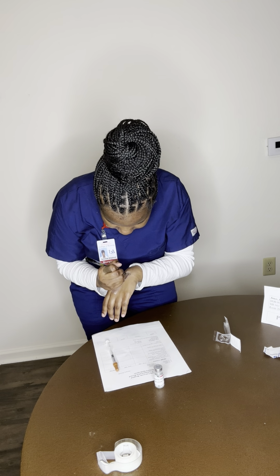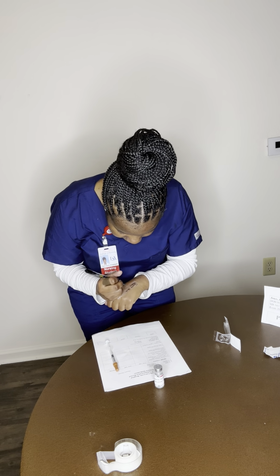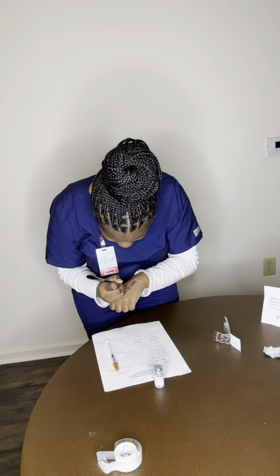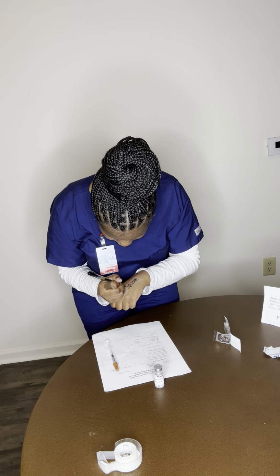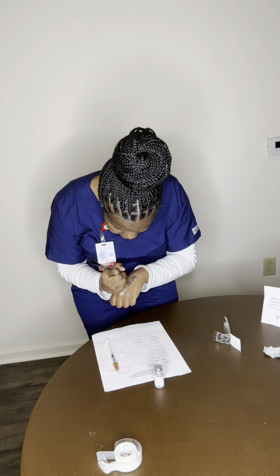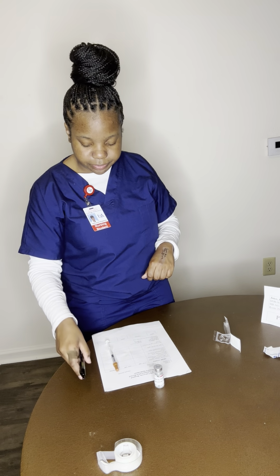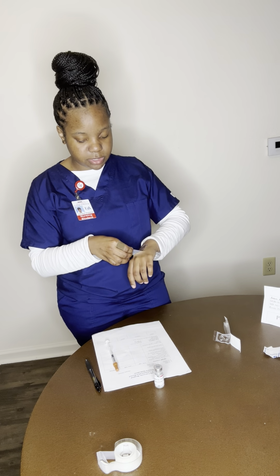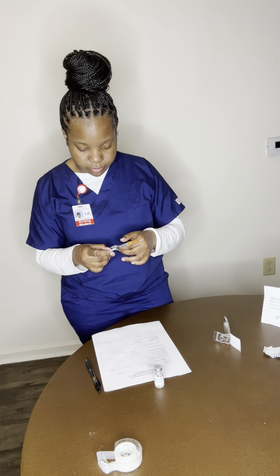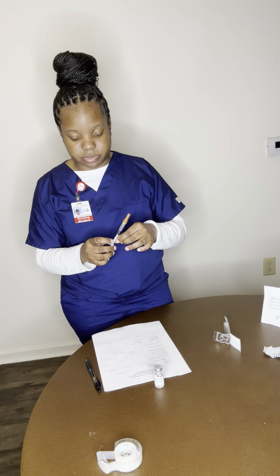They are given heparin 5,000 units, and that would be 0.5 milliliters. So I will take this and place it on my syringe.